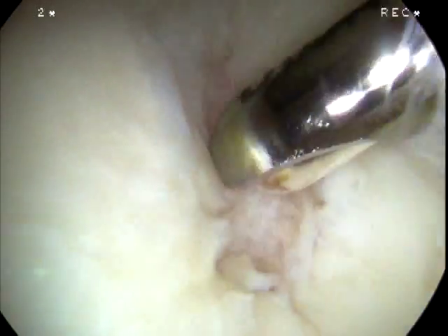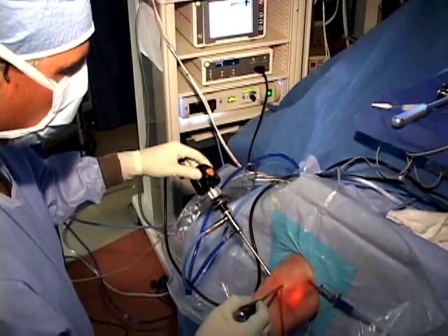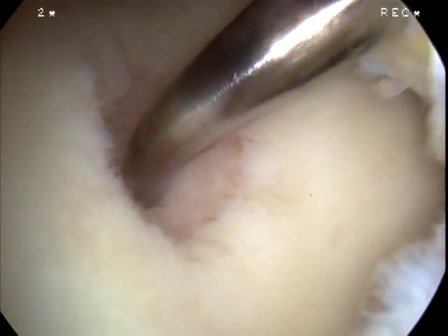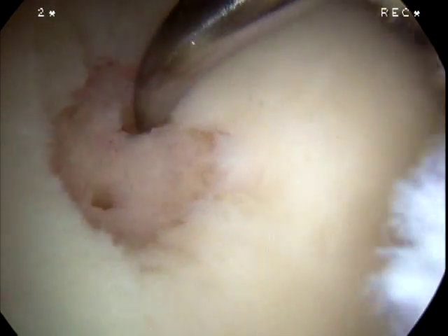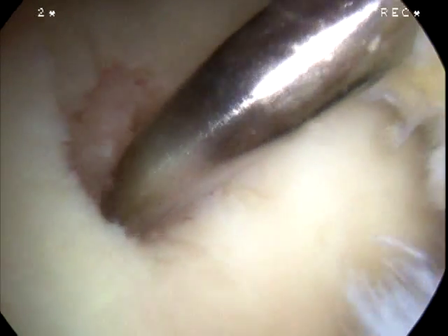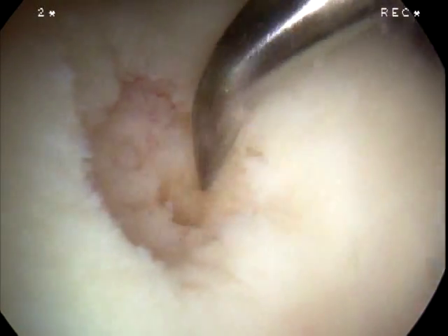A shaver is used to complete the debridement of both the free flaps of cartilage as well as the calcified bone in the eburnated area of exposed bone. All is brought into place and the bone morselized, which is a more extensive procedure than a microfracture alone. The goal here is to create a full bloody bed with complete disruption of the subchondral plate and complete removal of calcified or cystic bone that may be present.